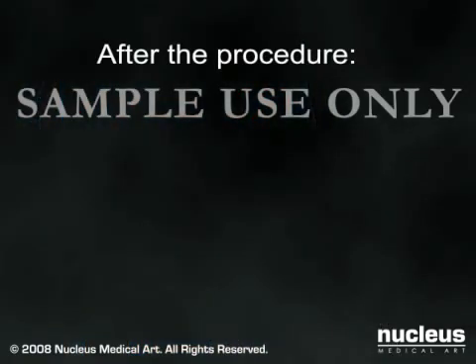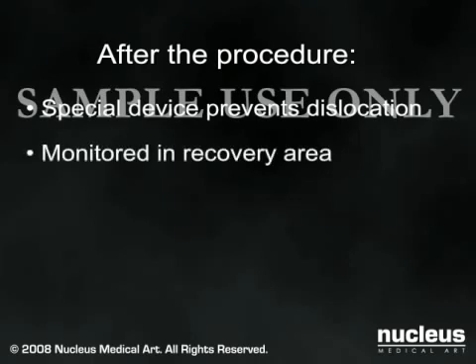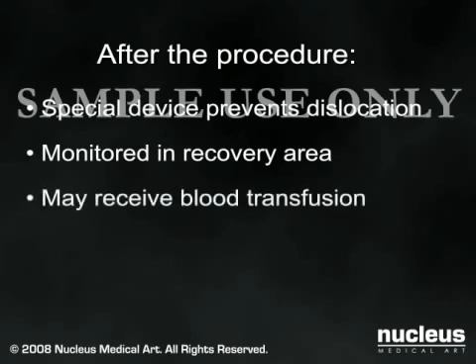At the conclusion of the operation, a special device will be temporarily applied to prevent your hip from dislocating. You will then be moved to the post-surgical recovery area until you are stable and awake from the anesthesia. If necessary, you may receive a blood transfusion at this time.